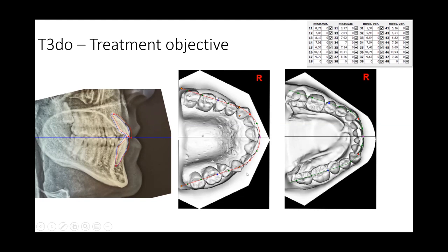I try to set the occlusogram that way. I think the general idea is perfect, Gabby. And I want to protrude the upper incisors because of the lips. The only thing we have to check in this case is the symmetry axis, because I'm not totally convinced.